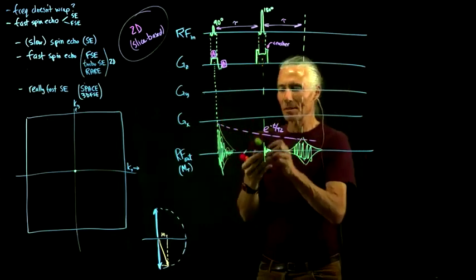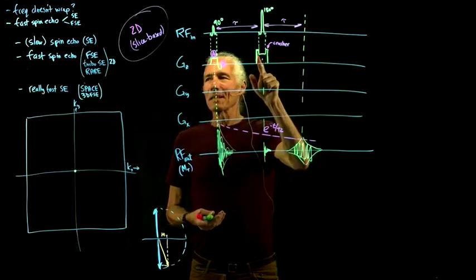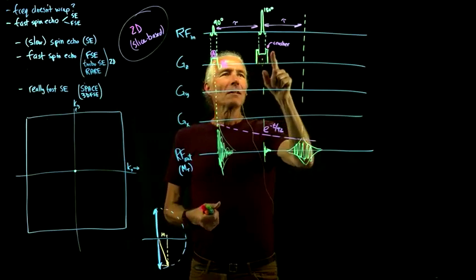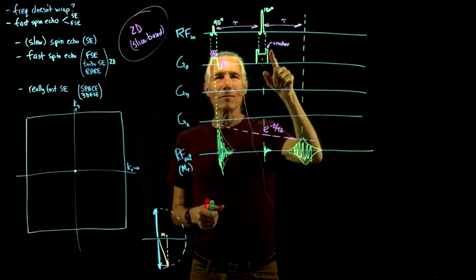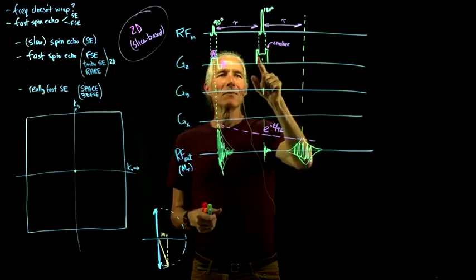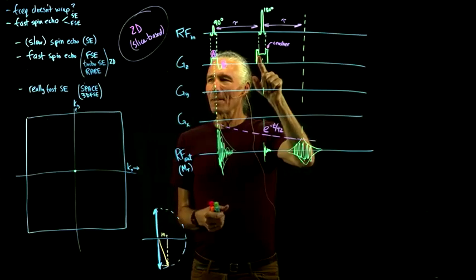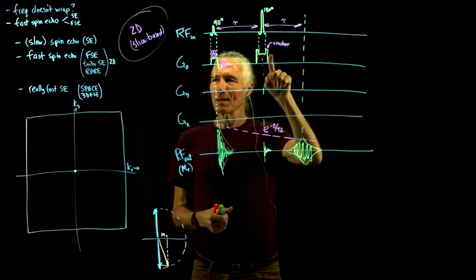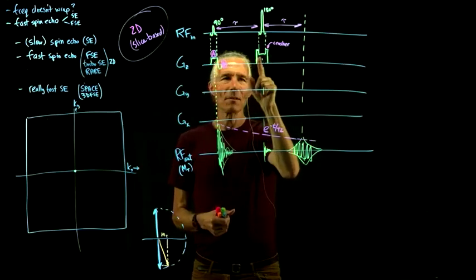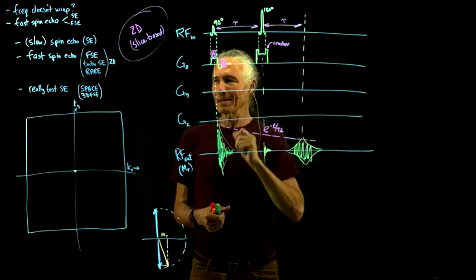And so this thing is, if this thing is going to mess up some transverse magnetization that we want, then what this one is going to do is pre-unmess it up. And then when we do this one, the effect of this one on the magnetization that we wanted to keep, that came from before, will be canceled, and so we'll keep it.